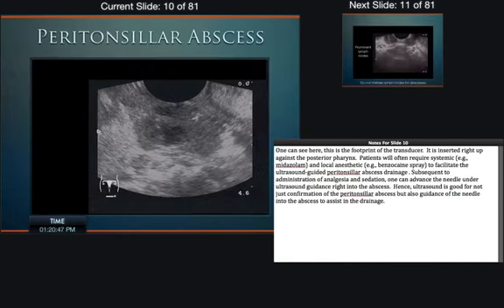So this is what an abscess looks like here in the back of the throat. This is the endovaginal footprint transducer, and this is all the oral mucosa back here. Some of this is air, because you're back there by air-filled structures like the esophagus and trachea. But this hypoechoic area right here is where there's actually a needle coming in. I don't know if you can see that little needle poking in right there. It's a little bit off-axis, off-plane, but sometimes you can make out that needle coming into the abscess.